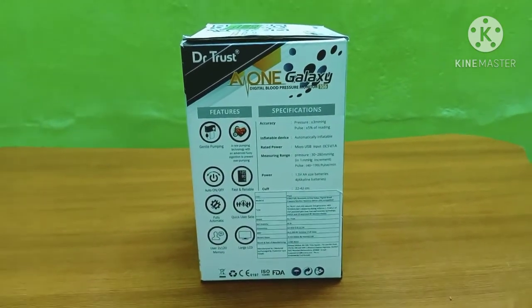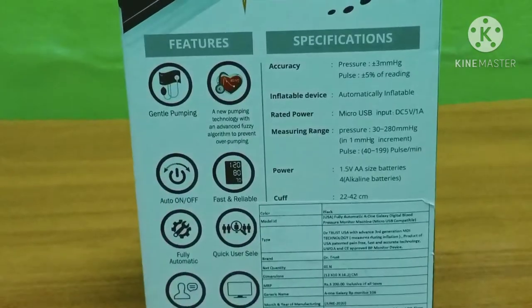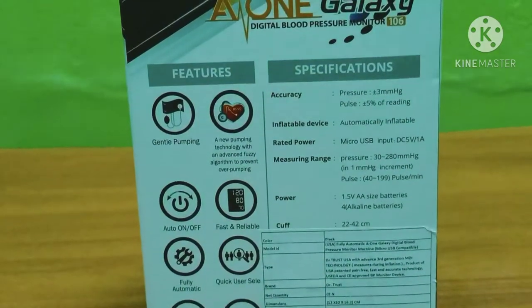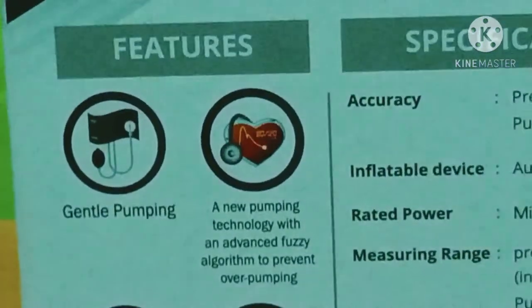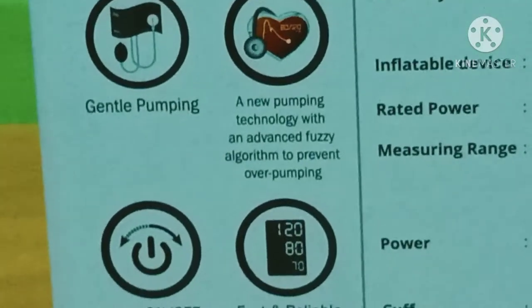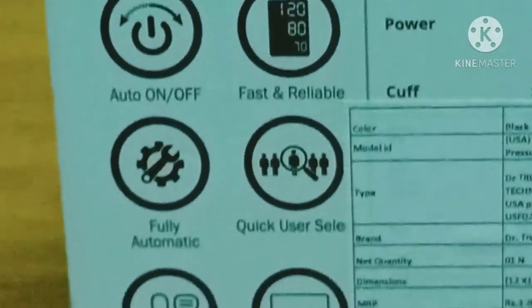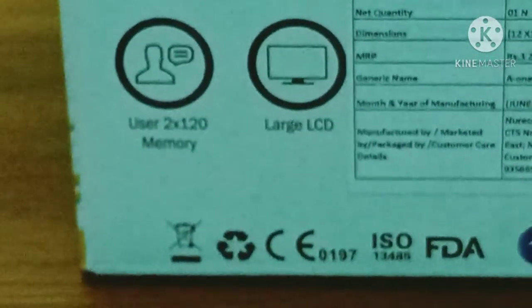Let's look at the features. There is gentle pumping, auto on-off, fast and reliable, and fully automatic operation. It uses a new pumping technology with over-pumping protection, 120 memory storage, and a large LCD screen.